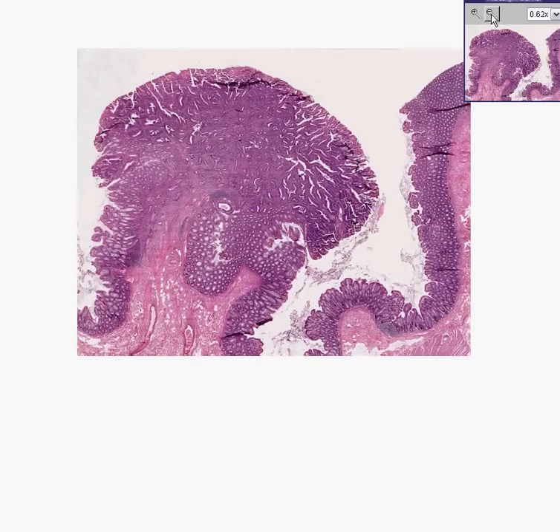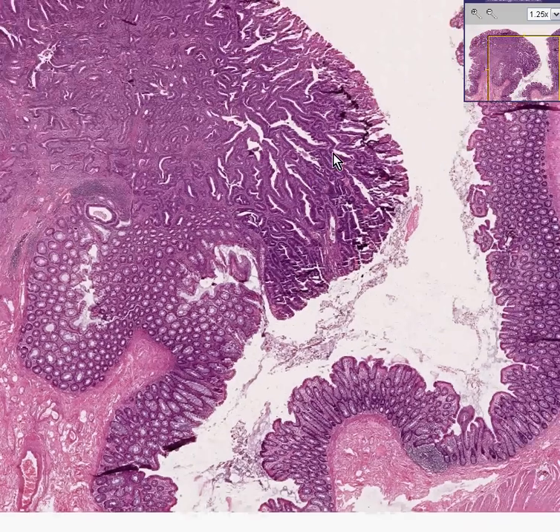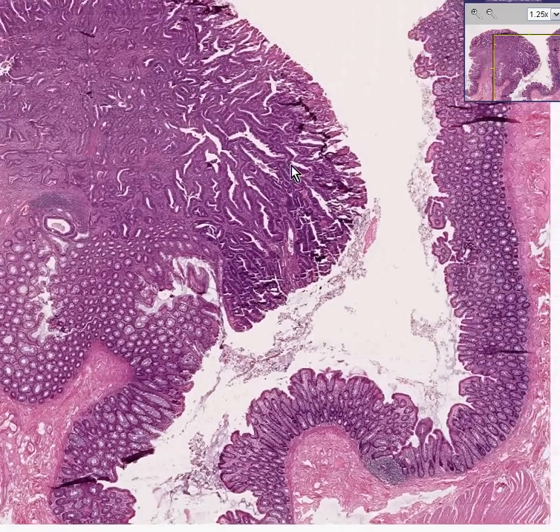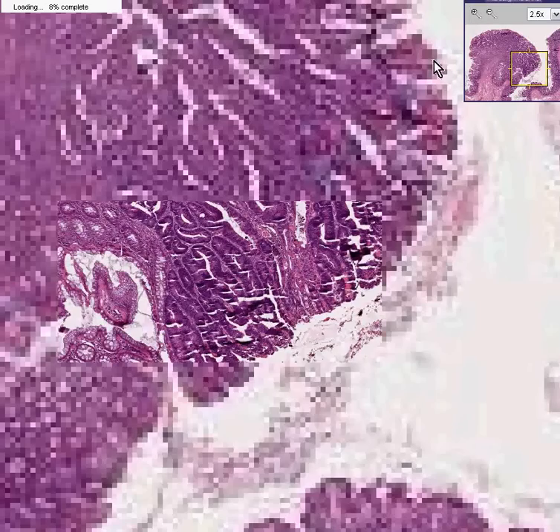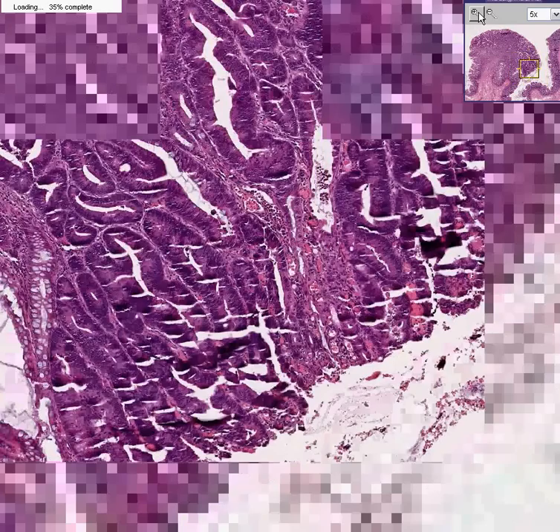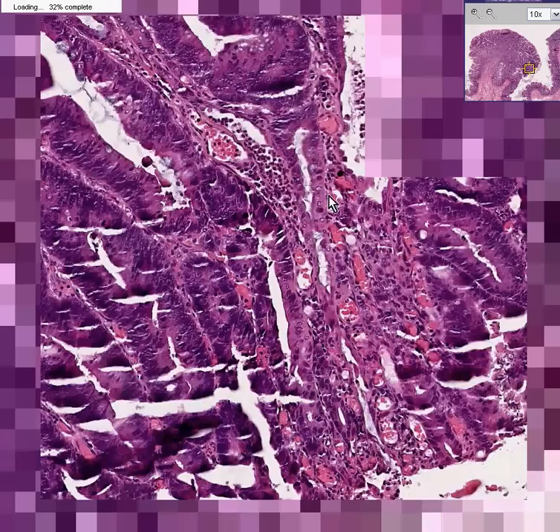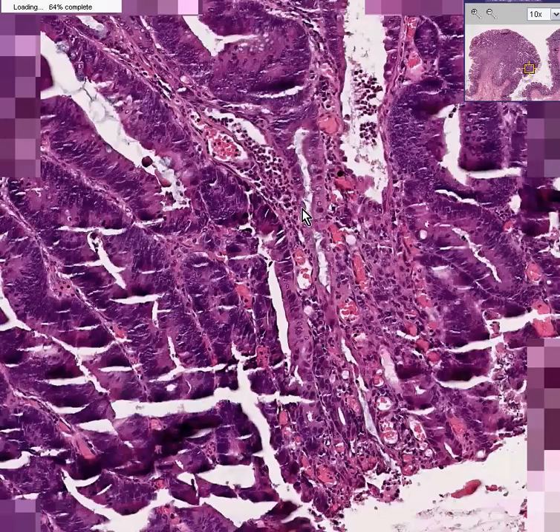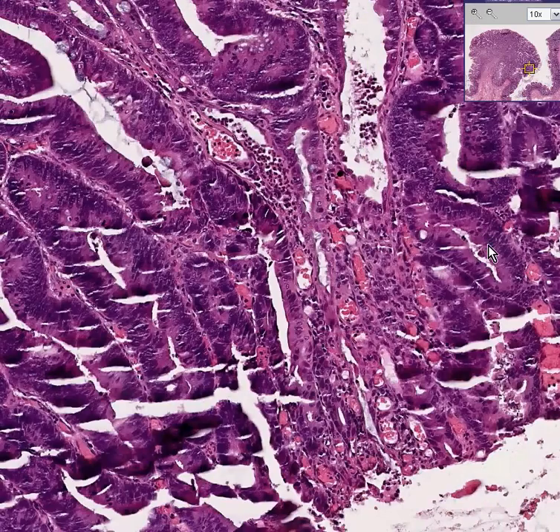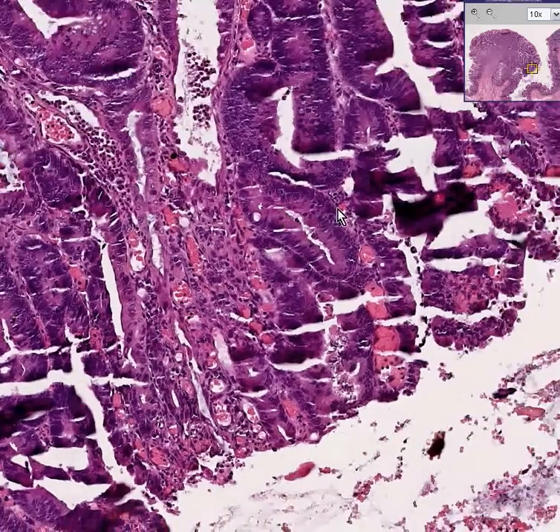This is a polyp, and because the glands of this polyp do not have serration — because they are all darker — they do not have much orientation of their nuclei towards the base.